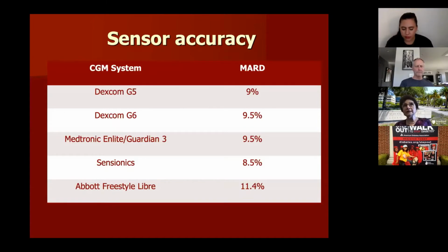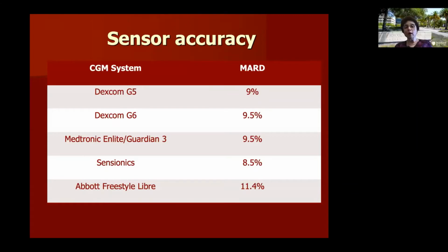There was a study looking at the accuracy of the meters, and Contour Next had been the most accurate meter. OneTouch meters tend to measure a little higher, and the FreeStyle and Accu-Chek tend to measure a little lower. So whichever meter you use sort of decides what the actual number is compared to the CGM.